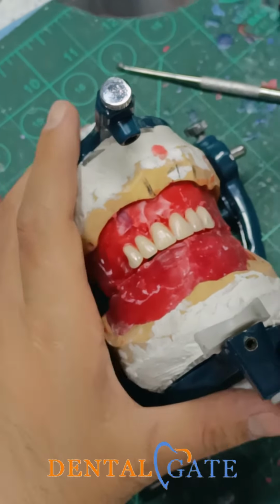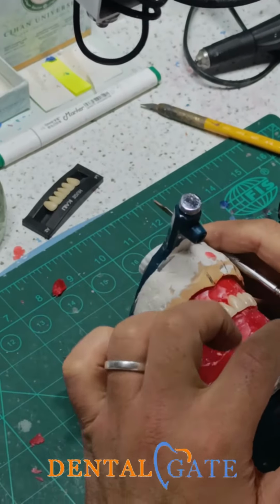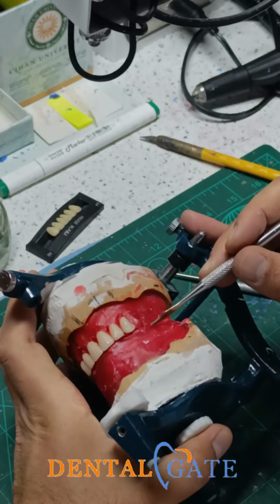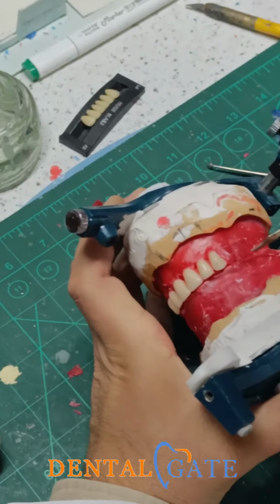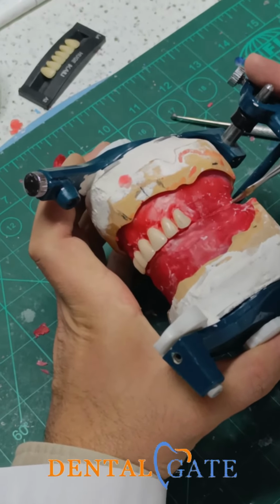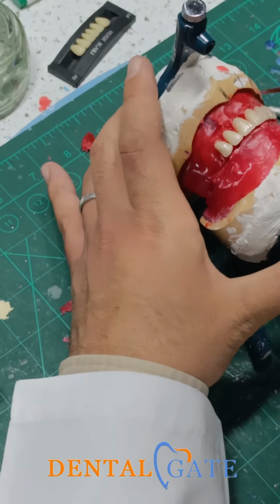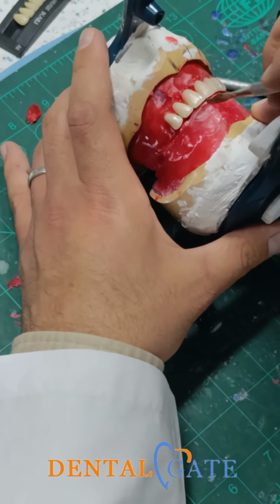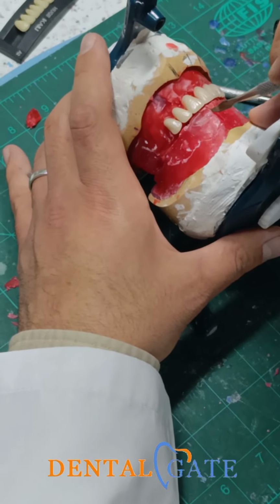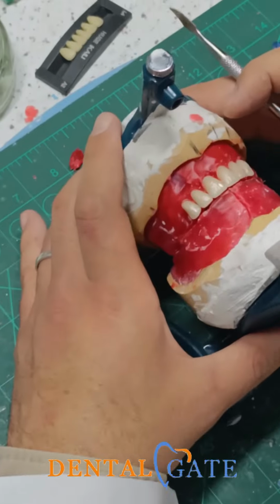Okay? So now, there is no table here, there is no incisive pin here. Please, we have one reference now. The bite rim should be fully adapted within the box. It will avoid error in the vertical dimension. Okay? So now, I will transfer my midline to the lower. And I will start with the lower teeth.